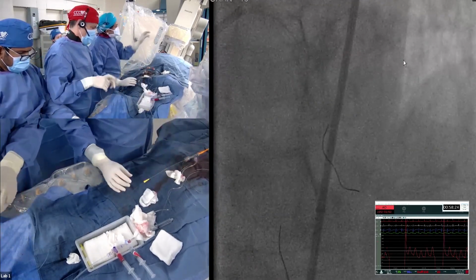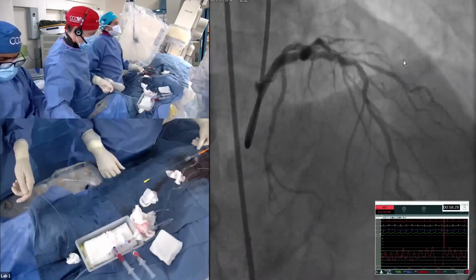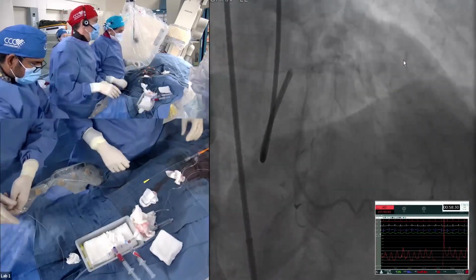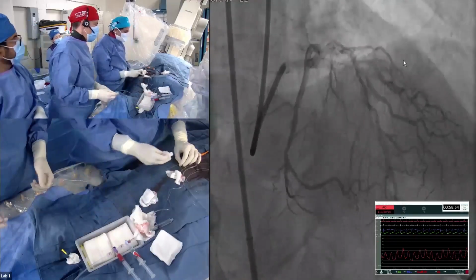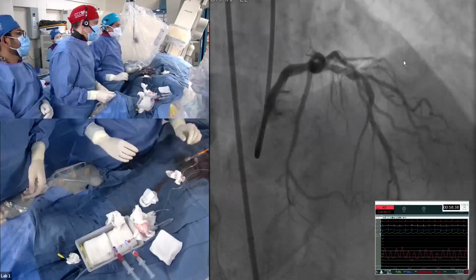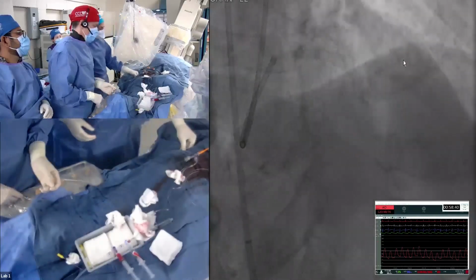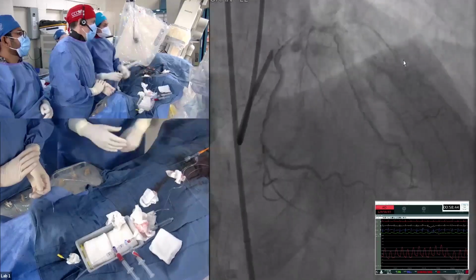Let us go back here. So you see that LAD, I know we are not dissected. Like John LaSala mentioned, we have done a good atherectomy with a 1.25 burr via the diagonal. Now, can we go back and do diagonal rota? Yes, I think that used to be once upon a time.